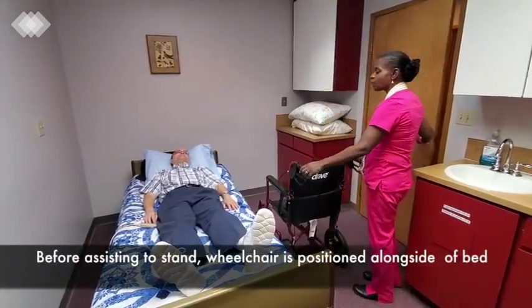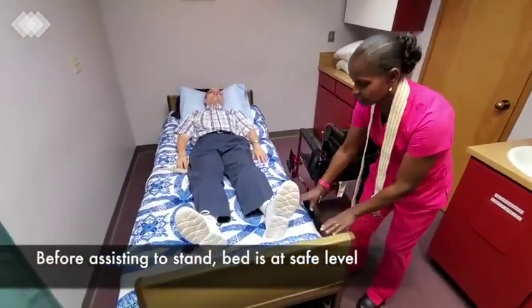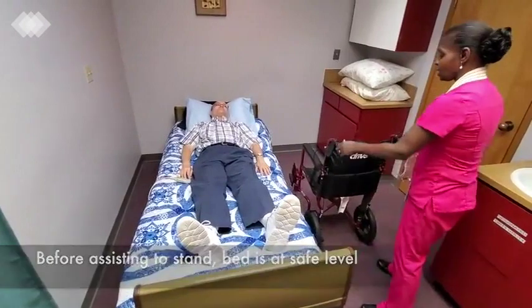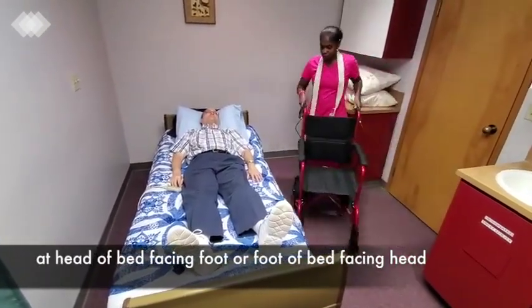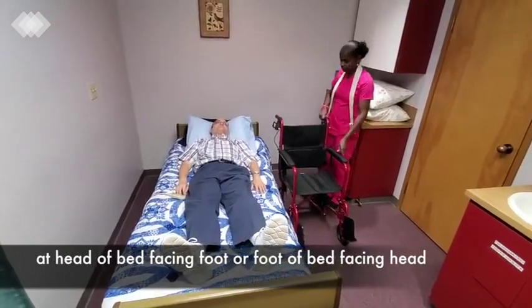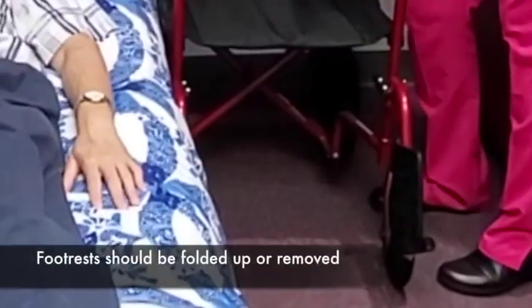I'm going to close your door for privacy. I'm going to check that your bed is locked and it is in a low position. I'm going to bring the wheelchair over to the head of your bed and I'm going to lock it with the hand brakes.